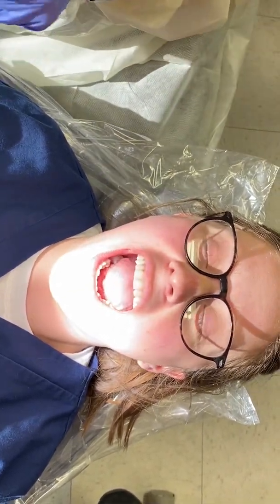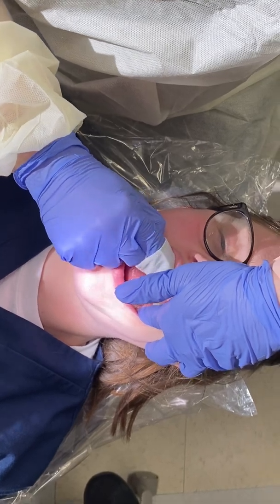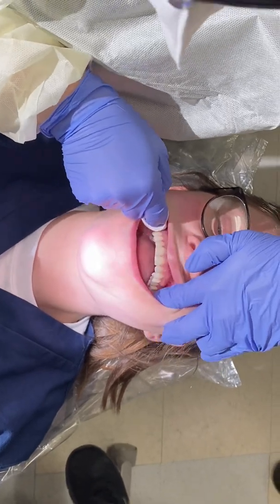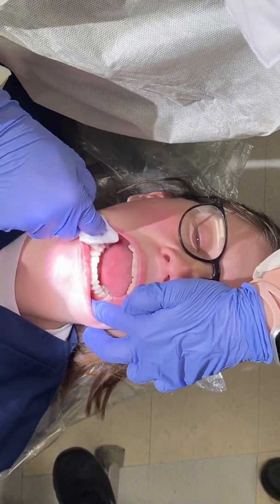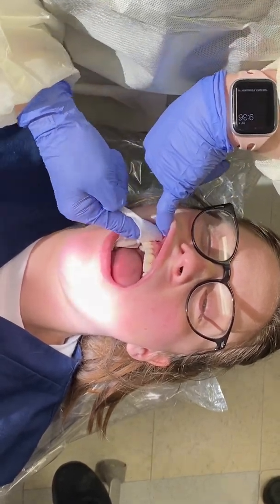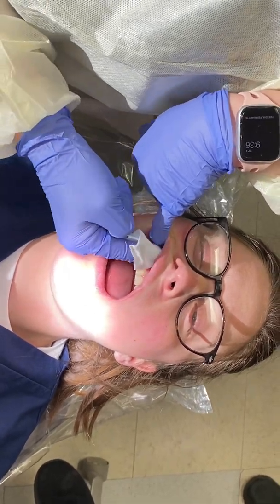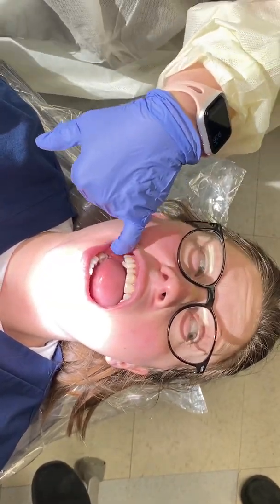So the easiest way to observe them dry is to wrap this around your finger and then to go ahead and take it and use it in a sweeping motion. And then you can do it in quadrants, okay? So when you do that sweeping motion, you can look right away and observe it dry. Observe it dry. And be careful because there are some frenums up here, okay? The maxillary frenums. Just be careful when you're going over that. And then observe it dry, okay? And then we'll be ready to palpate it separately.